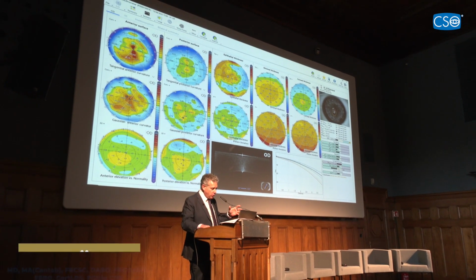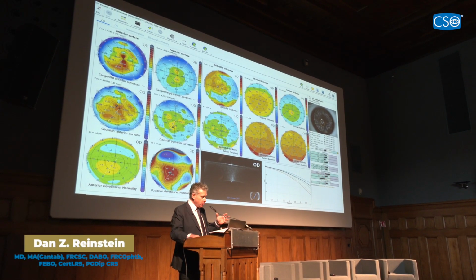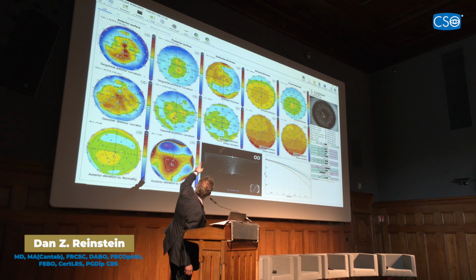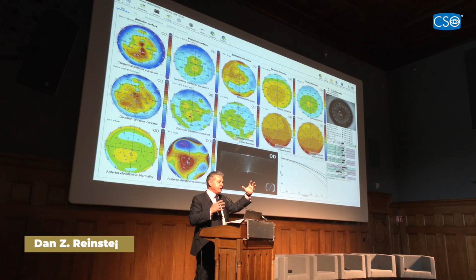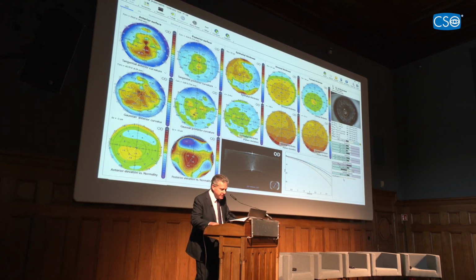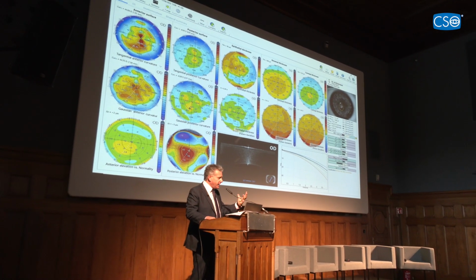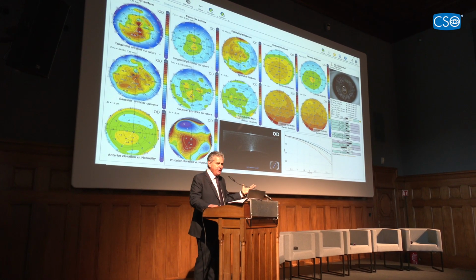In fact, you can normalize the back surface as well, just so that you can see exactly where the points are. And what I do is I'll put the cursor on the maximum point of elevation and check where that corresponds on the map. Because sometimes there might be epithelial thinning, but it's not correspondent with the back surface elevation. And I mean, this one does classify the cornea as borderline because the anterior surface has this large asymmetry. But qualifying that, it could have easily been thickened epithelium, easily, and then it's not keratoconus at all.